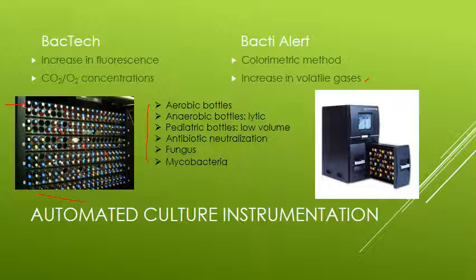You actually have to still concentrate the specimen, acidify the specimen, all that stuff. You have to do the normal concentration procedure, and then you inject it into the bottle, put the bottle in the machine. But it is usually at this point used to enhance the manual methods, because with the manual methods you don't get growth for 7, 14 days, whereas in the instrument we do get growth literally 48 to 96 hours. We've seen growth from a sputum, so that's pretty good recovery, much faster.